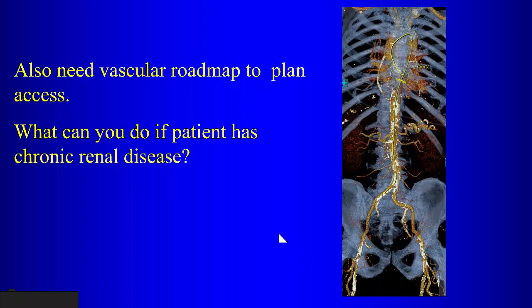If a patient has chronic renal disease, right, obviously you have to do a CTA, right? What can you do to reduce the contrast dose?